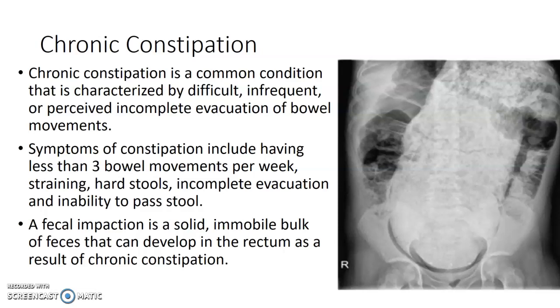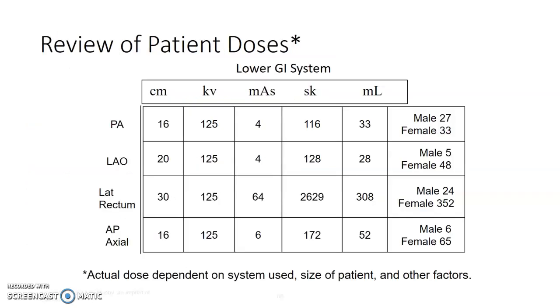If you do one of these water-soluble clean-out enemas, make sure you have that Barbie pool blown up, because that patient most likely will not be able to hold that enema tip in, and it's going to go all over. So be prepared. Just a review of patient doses per your patient position for BE.